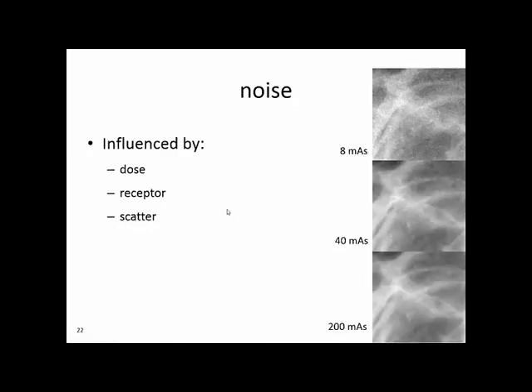The next property is noise. Noise is an image property that goes with different parameters in DR. Mostly, I would say they are influenced by the dose that you apply. And here we are back again to the discussion of technique settings that still apply also on DR. So we need to find the right dose to create the right image impression in terms of noise.